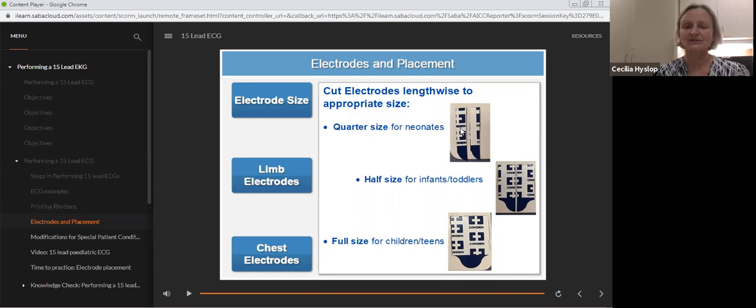And so they may actually have misinformation about the heart and are making some determinations about areas of the heart where the sticker is actually not overlying. So number one critical principle is that if you can't place a sticker where it should be, then just leave it off. It's better to leave it off than place it in the incorrect spot.